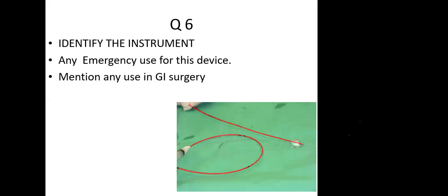How do you know that your pulse oximeter readings are adequate? So check with the opposite limb. Very nice. So this is exactly the trick question. You check it with the opposite limb. Okay. And then if there is a questionable vascularity, say you have done an embolectomy between 4 to 6 hours.